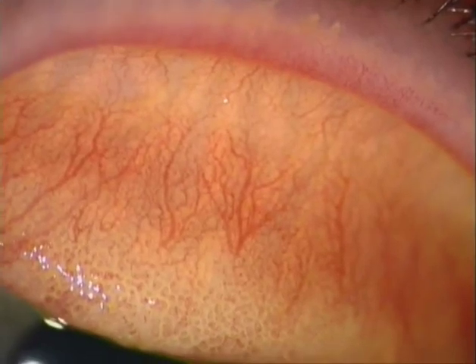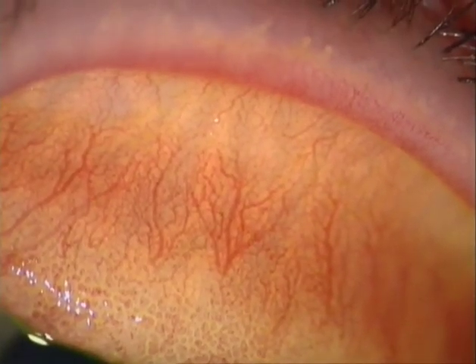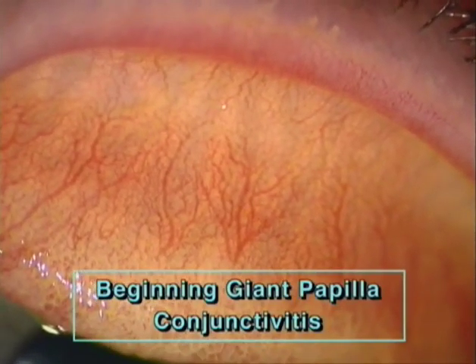The typical pattern of papillary carpets appears most distinctly in a case of exaggerated papillae formation, such as here in a beginning giant papillar conjunctivitis. Here, the tissue of the rim has become opaque, and thus we see the capillary buds in sharp contrast against the whitish neighbourhood, and the rims are delineated by staining the intervals with fluorescein.